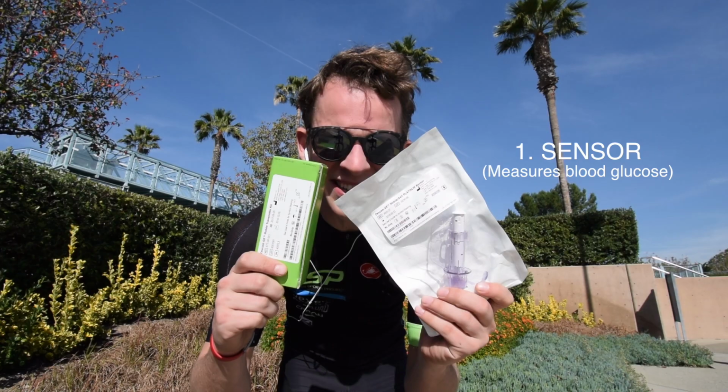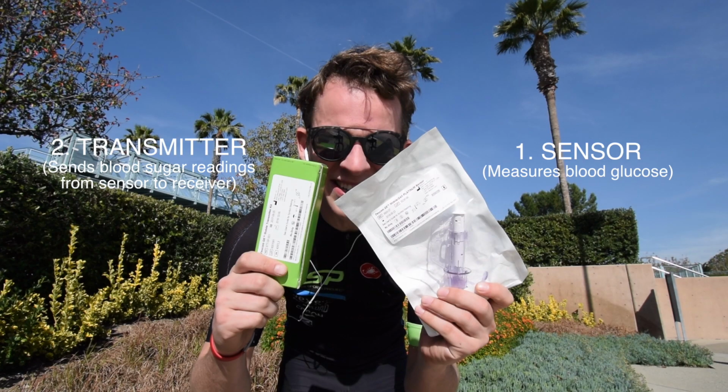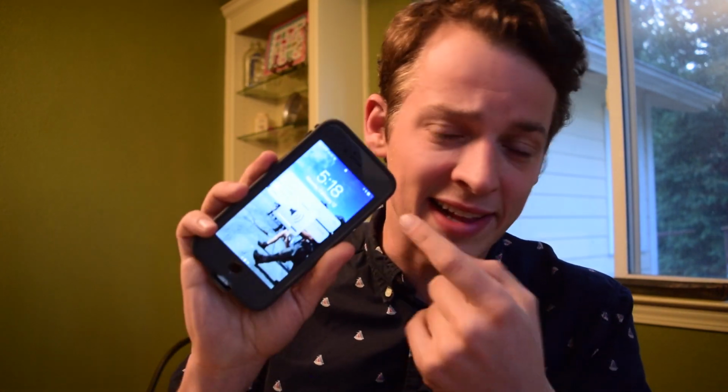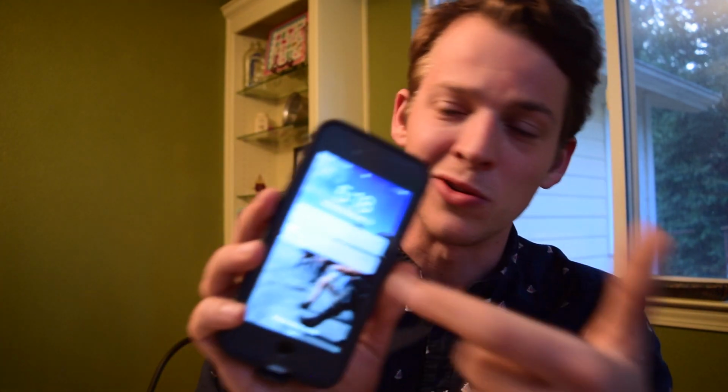you need to understand a little bit about continuous glucose monitors. There's three parts involved in the system. One, you have the sensor. That's the thing that comes in the plastic wrapping. It's what goes underneath your skin to actually get the readings. The second part is the transmitter, something that takes the data and sends it to a receiver, which is part three, which is pretty much a smartphone nowadays. And that's mine beeping right here. See, it says low glucose alert.